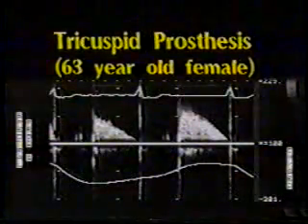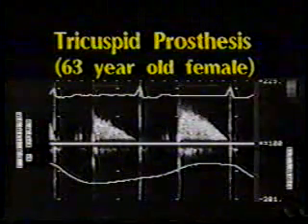This patient has Starr-Edwards tricuspid and mitral prostheses. Here, the non-imaging transducer has been angulated toward the tricuspid prosthesis. These signals can be distinguished from mitral signals by the characteristic respiratory variation. You'll recall that the tracing from the nasal respirometer rises with inspiration and falls with expiration. Compared to expiration, inspiratory cycles show an increase in early peak velocity as well as an obvious increase in mean gradient.